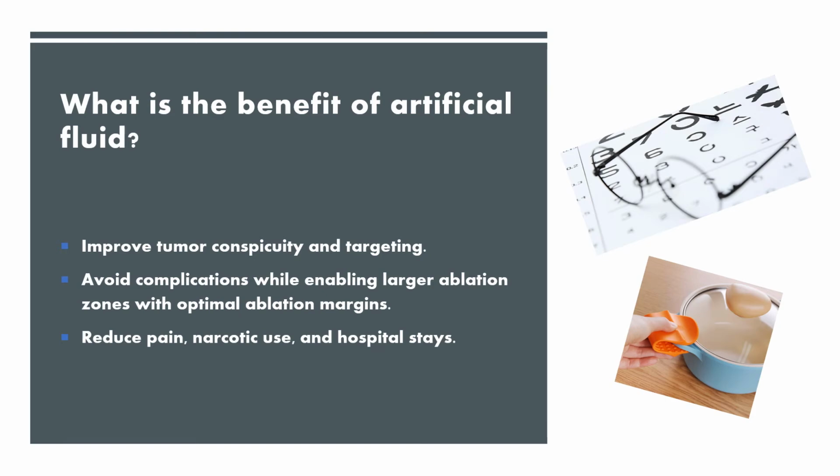What is the benefit of artificial fluid? We can improve tumor conspicuity and targeting, and we can avoid complications while enabling a larger ablation zone with optimal ablation margin. And also we can reduce pain, narcotic use, and hospital stay of the patient.